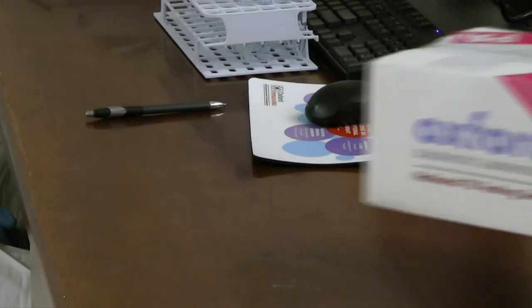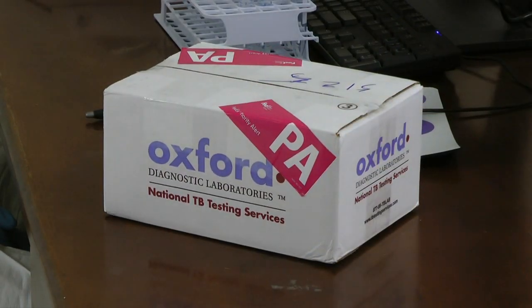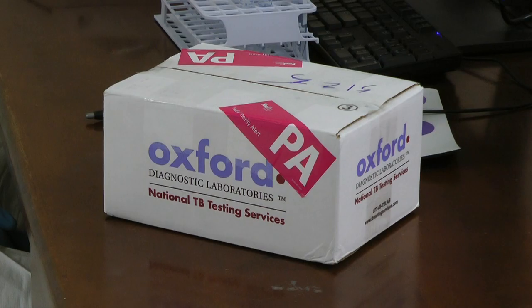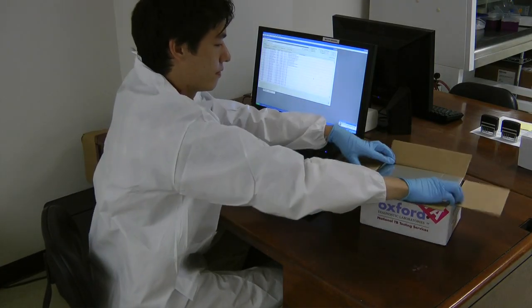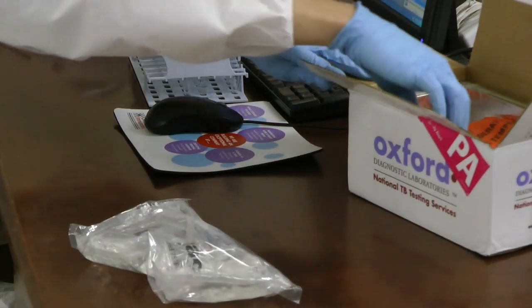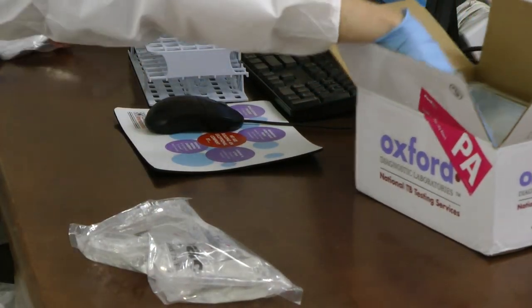Whole blood samples are submitted to Oxford Diagnostic Laboratories in customized shipping containers which ensure samples are maintained at room temperature throughout storage and transit. Upon receipt, the boxes are opened and the contents are removed.